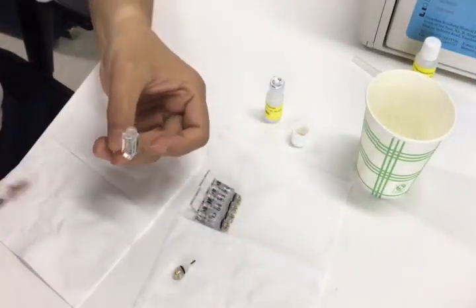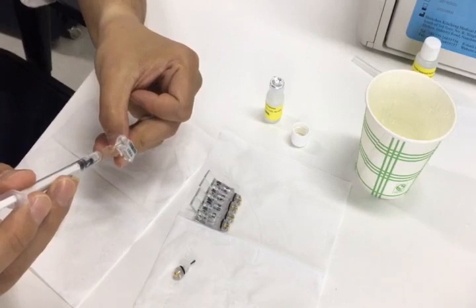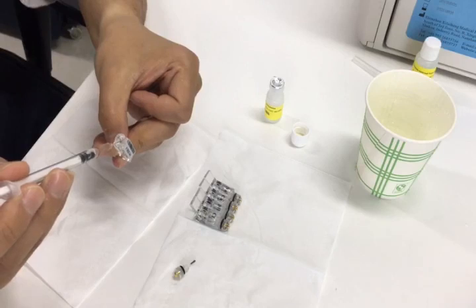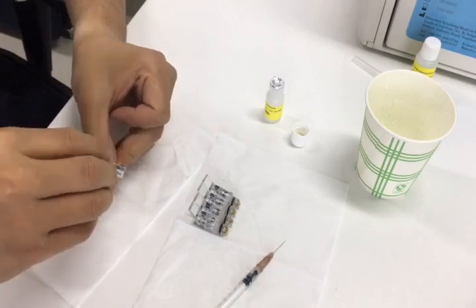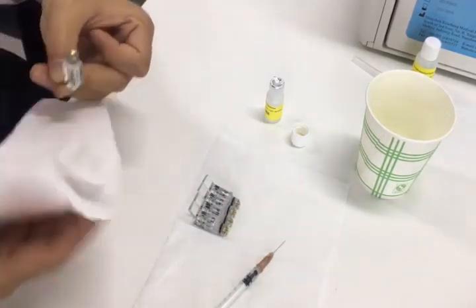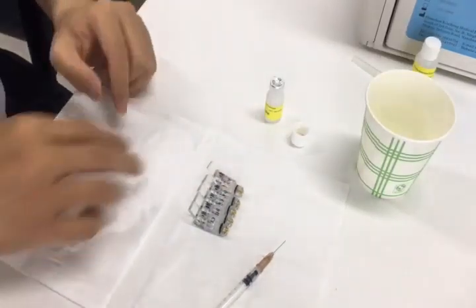Then remove it out, and put the rest of the solution into the electrode. Tilt the needle to avoid damaging the membrane, and push the syringe very slowly. Then close the cap. Use the tissue to clean the metal contact for the electrode and the gas ring. Pay attention to the volume of the inner solution. The rest of the electrodes follow the same procedure.